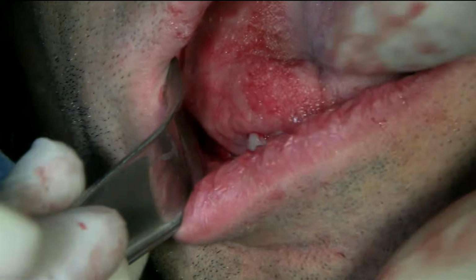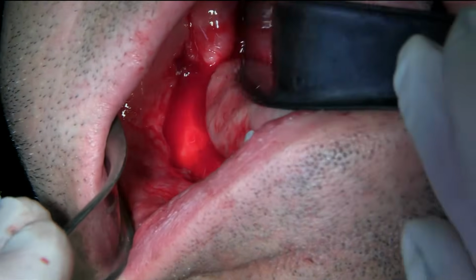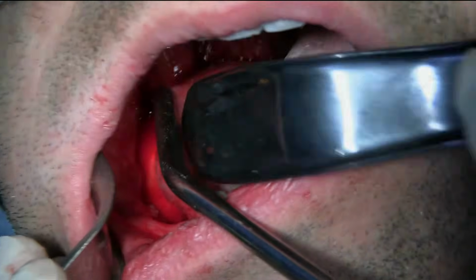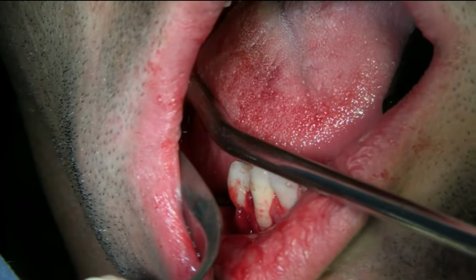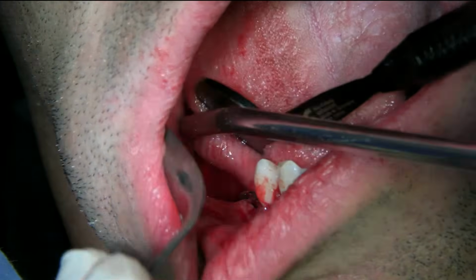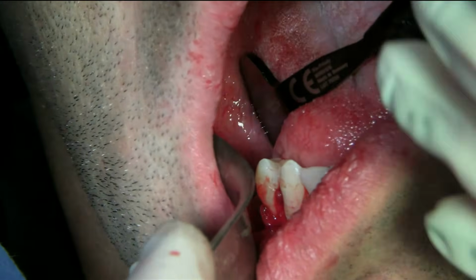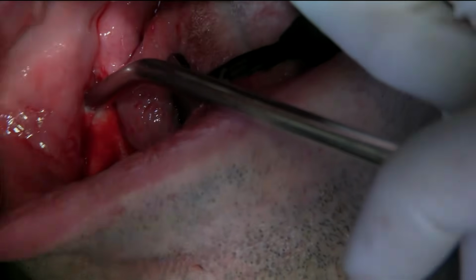Okay. Retract the tongue again. Yes, sir. Give a mirror. I don't think the tongue goes with the Minnesota. It's too hard. Just like here. Relax. Okay. Not easy, we know.